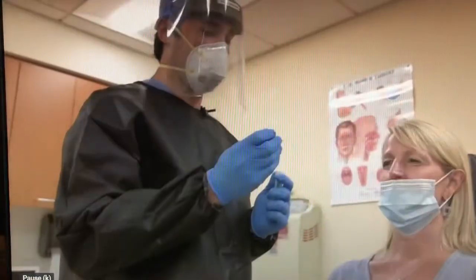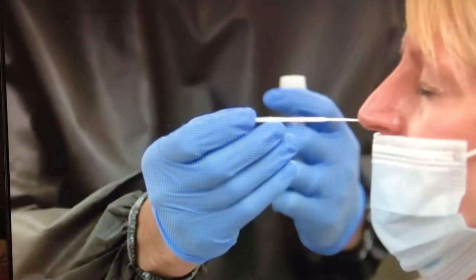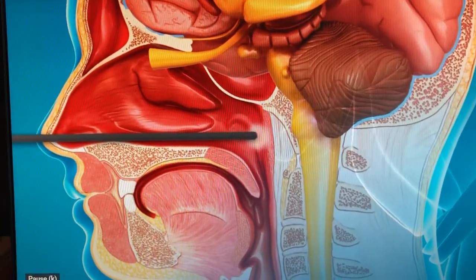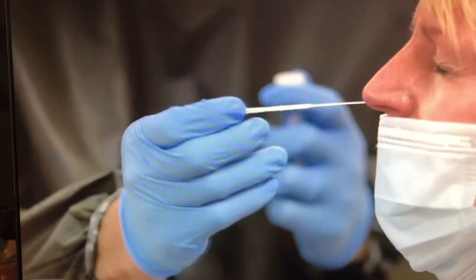To perform the nasopharyngeal swab, the swab is inserted and advanced straight back towards the nasopharynx approximately seven to eight centimeters. It's then twisted back and forth for about three to five seconds and removed.